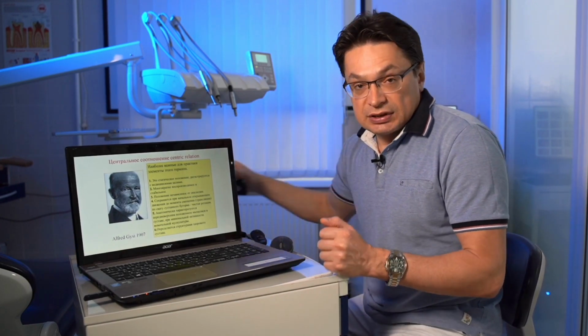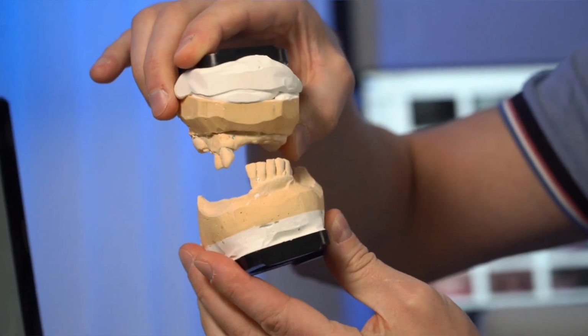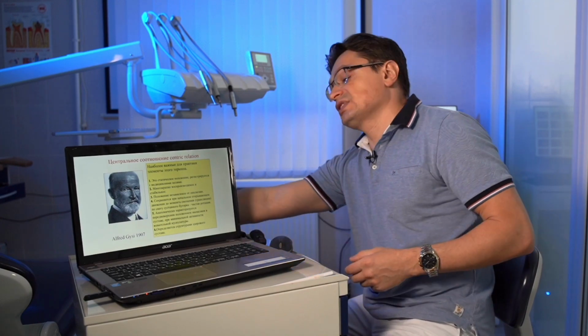Again, even if we have teeth, but only a few teeth, as in this case, what is called a non-fixed bite. Focusing only on these teeth, what can you get? You may receive the error that actually led the patient to you. Therefore, we need to find that specific ratio of the jaws that will allow us to carry out the correct prosthetics in the future, or orthodontic treatment, diagnostics and treatment planning, and so on and so forth. That is, there are quite a lot of indications for the CR that we need in our work, and today we will try to deal with them too.